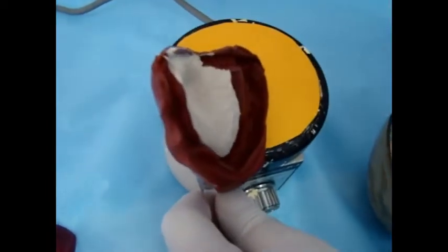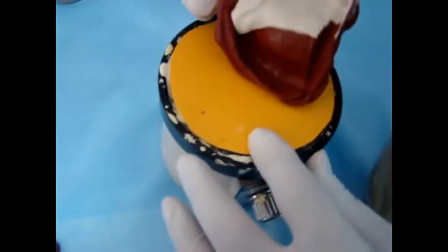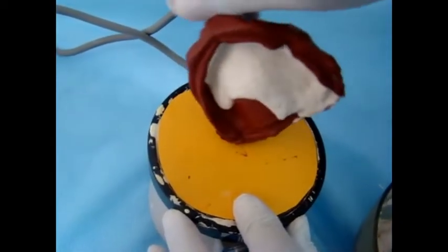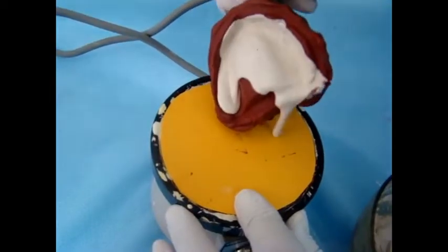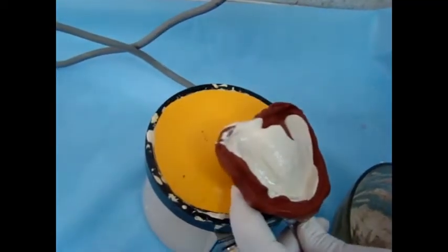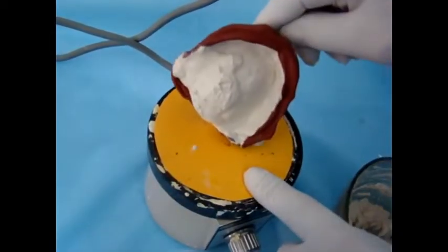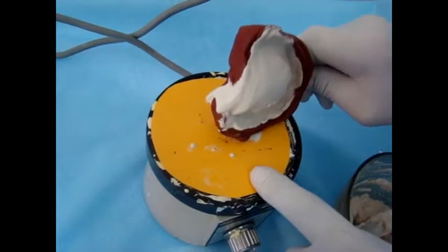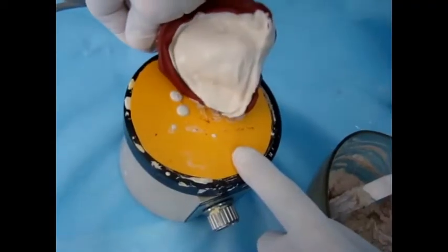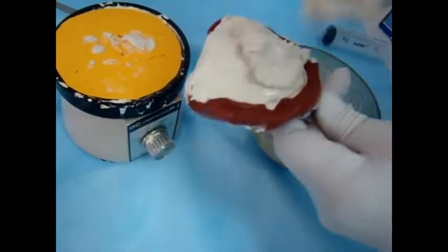Then on the vibrator we place the first pour. We place the plaster of Paris mix at one side and on the vibrator we move it to the other side — this is the first pour of plaster of Paris. Make sure that it covers the fitting surface of the impression, and let the material flow from one side to cover the impression on the other side.